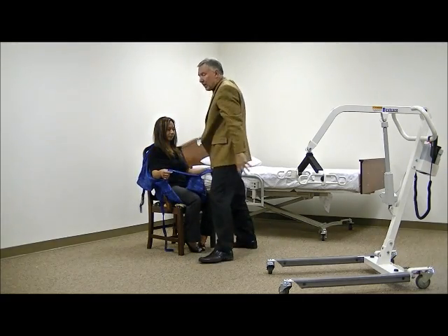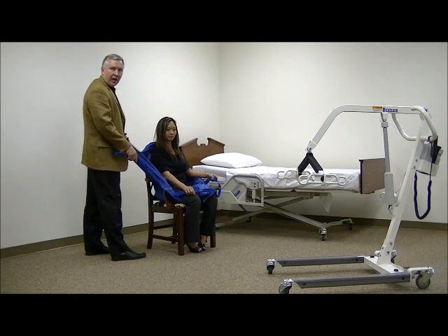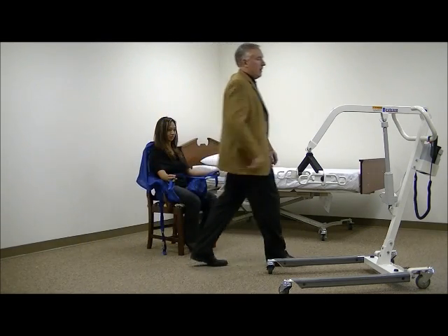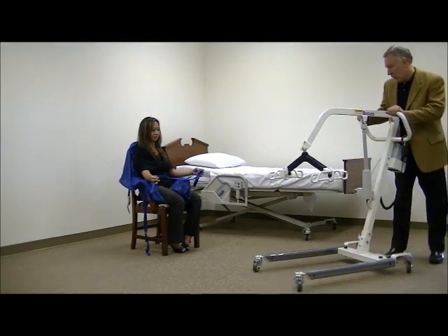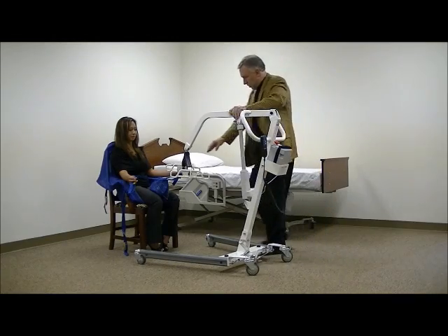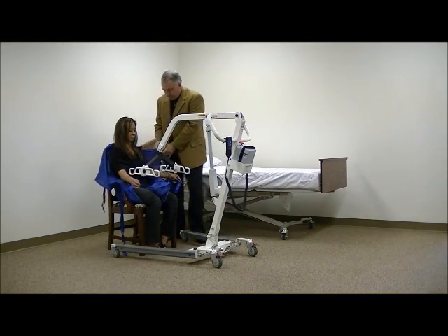Now if you noticed on this sling, there's 3 sets of loops on each side: shoulder, midsection, and leg. So on both sides, and you got 3 hooks. So you'll probably already understand what we need to do next. We're going to open up the base, approach the individual with the lift, and we're going to connect the sling.